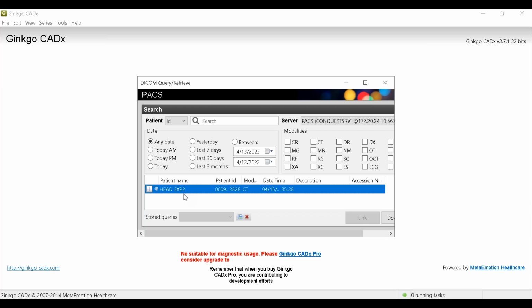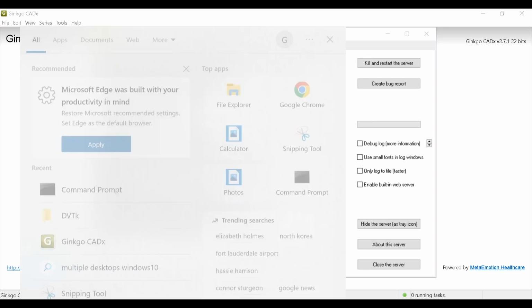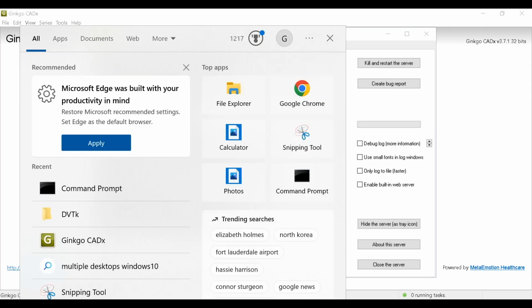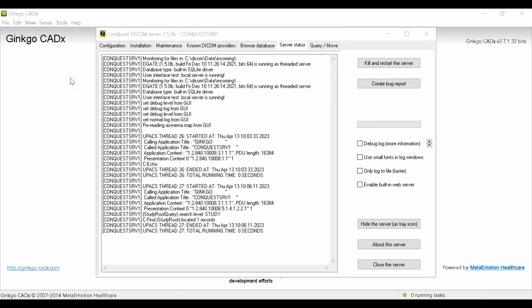Essentially, at this point in time, folks, we've succeeded. We've created the lab. Let me go over to the software over here in the server and I'll prove it. Notice this. Ginkgo requested my software. I'm going to do something here. I hope that the recording does this. Those of you that have been my students, you know I love doing stuff like this. There we go.